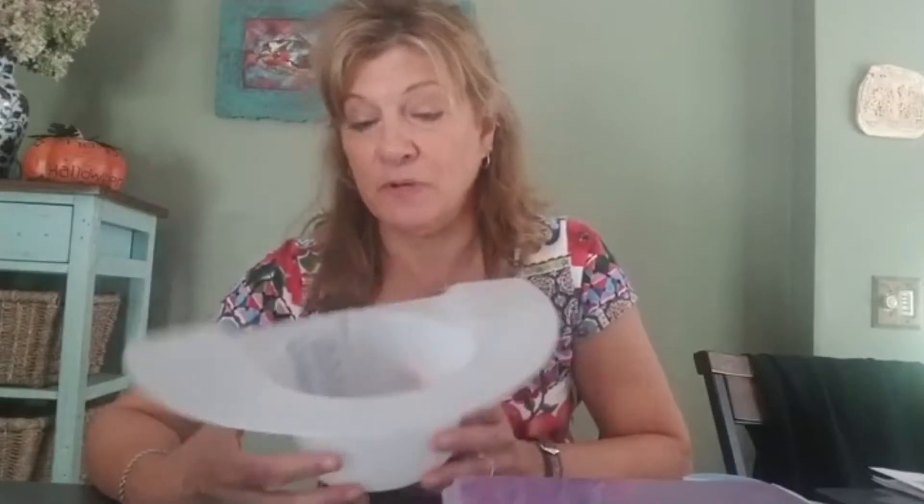Another thing that may help with collecting urine easier for a man who can't stand is something called a hat, made by Precision. It looks like a little container with markings on the side and is also used on commodes or in toilets to measure urinary output. It has a little scoop on the side so you can pour urine right into the cup. These are pretty much throwaway — I don't recommend reusing them, and they're not expensive.